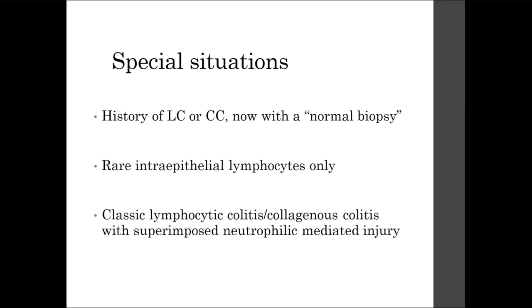We have to make a comment here also that the disease is patchy, so sometimes it's a sampling issue that I want you to consider. Sometimes it's an effect of treatment. Patient now is in true remission.